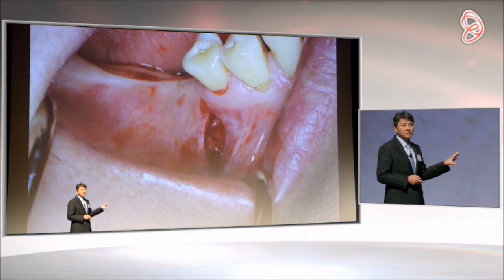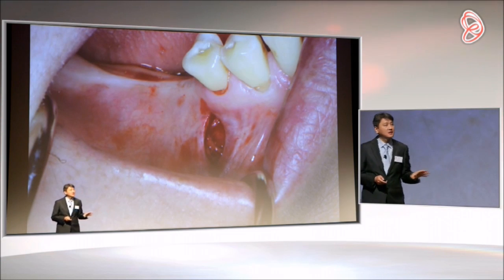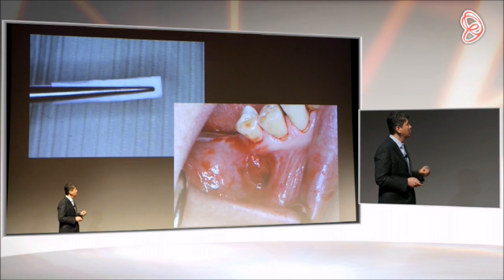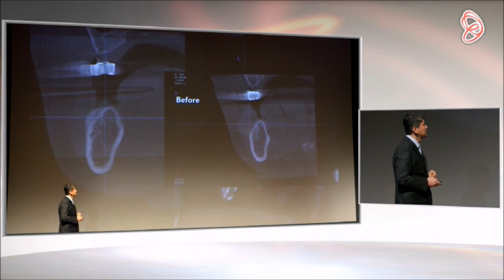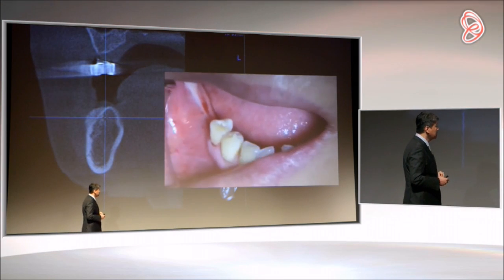Same procedure, you just have to respect the mental foramen, and we make a very long tunnel, and we will use collagen membrane. Let's look at the video.